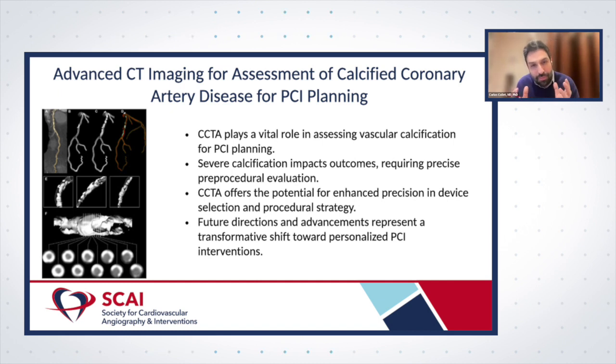So it's extremely interesting for me to see that 10 years ago, having a high calcium score was almost a limitation for the technology to make a diagnosis in terms of obstructive or non-obstructive disease. Now we see the ability of CT to detect calcium as an advantage in order to understand how severe the calcium is, what is the circumference of the calcium, the length of the calcium, the thickness of the calcium.